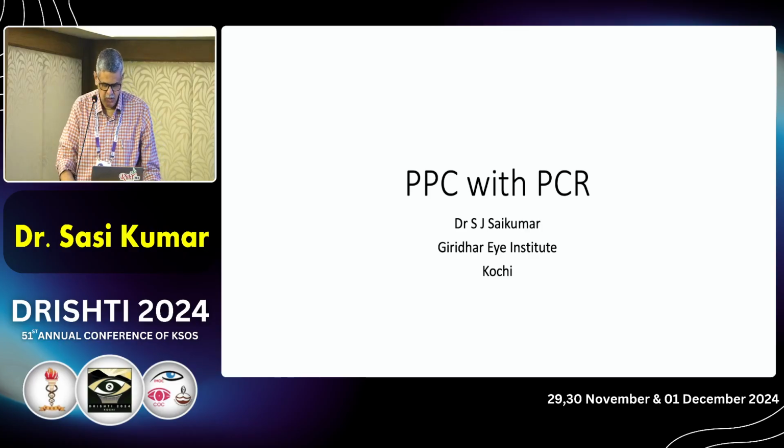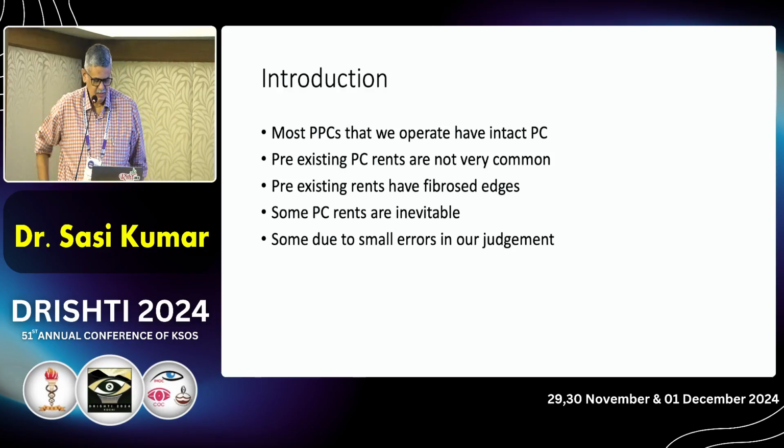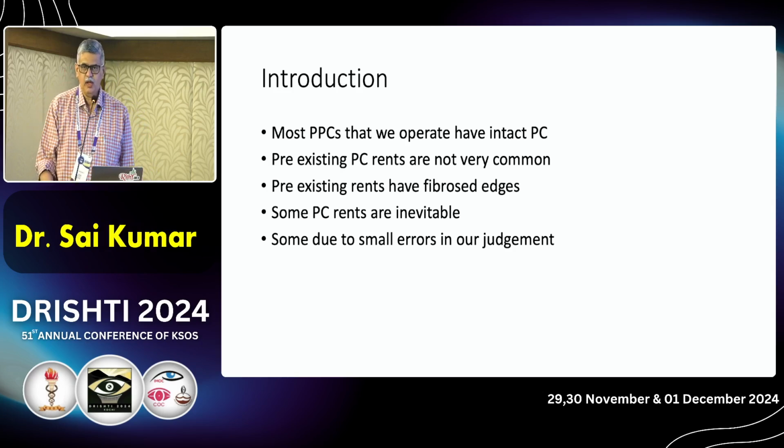The moment we hear about posterior polar cataract, your heart sinks. You are wondering what to do, whether you'll have a drop, whether you have to have a backup. So these are the thoughts that go through your mind. I have been given the topic of posterior polar with PCR, so I am showing only PCR videos, not the normal videos. But just a few points of introduction.